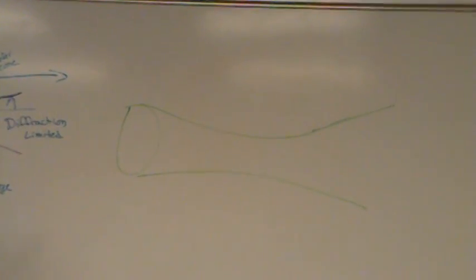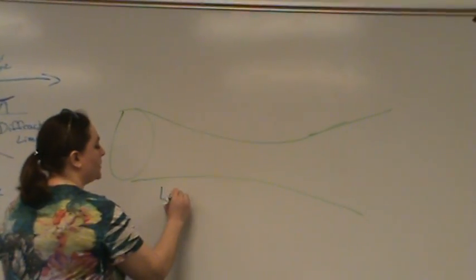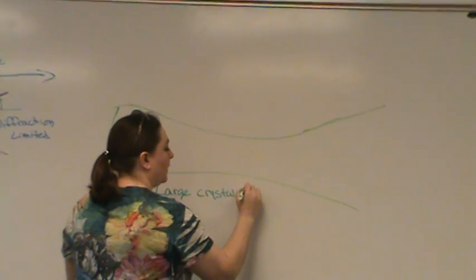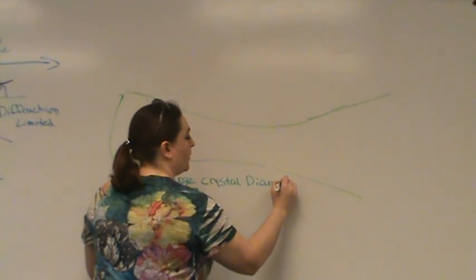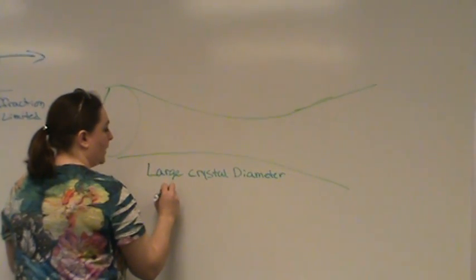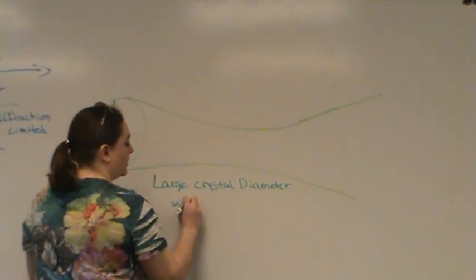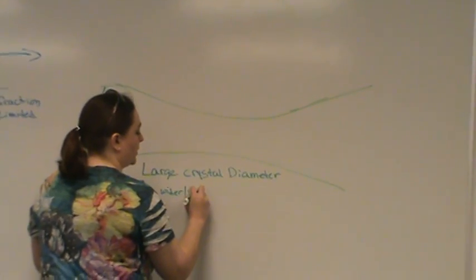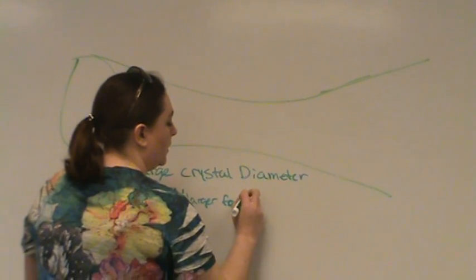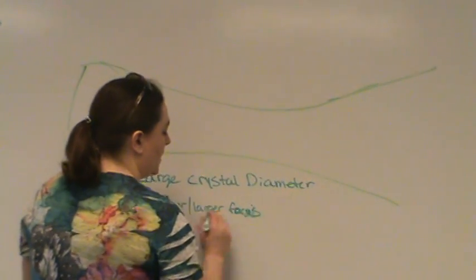So large crystal diameter, we end up with, of course, a wider or larger focus.